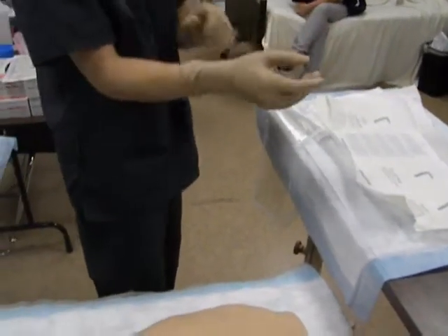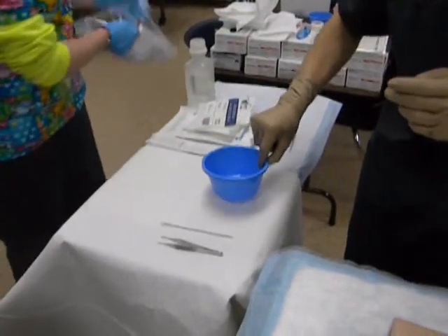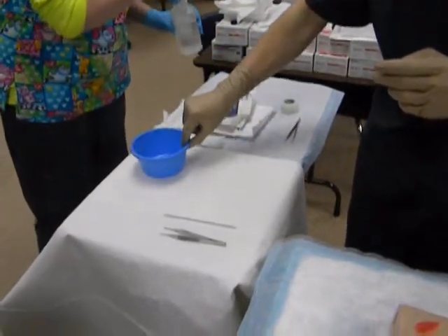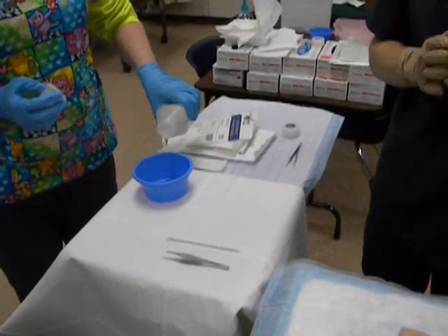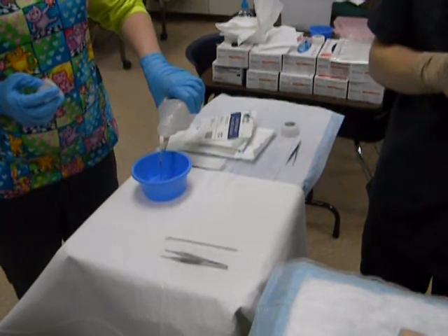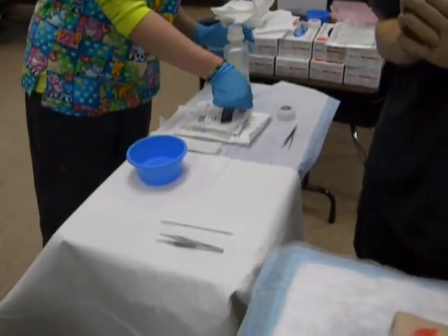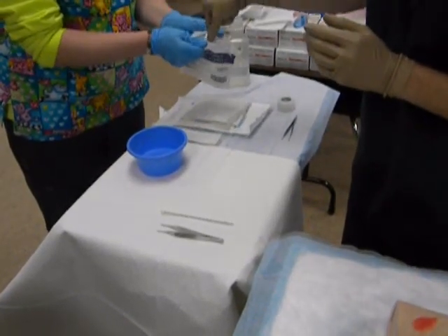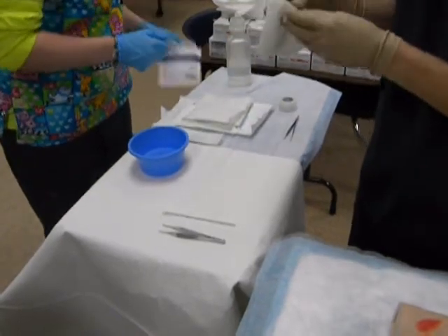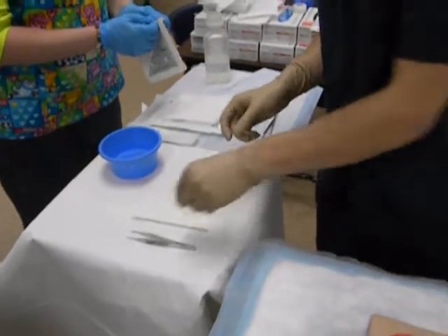Okay, now with sterile gloves donned, we are able to go ahead and begin to set up our sterile field for the dressing change. As we set up our sterile field, we are going to be assessing the patient's wound for a number of things.